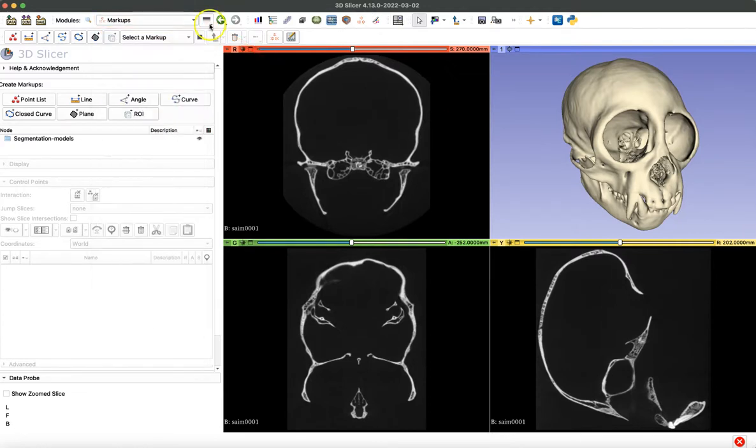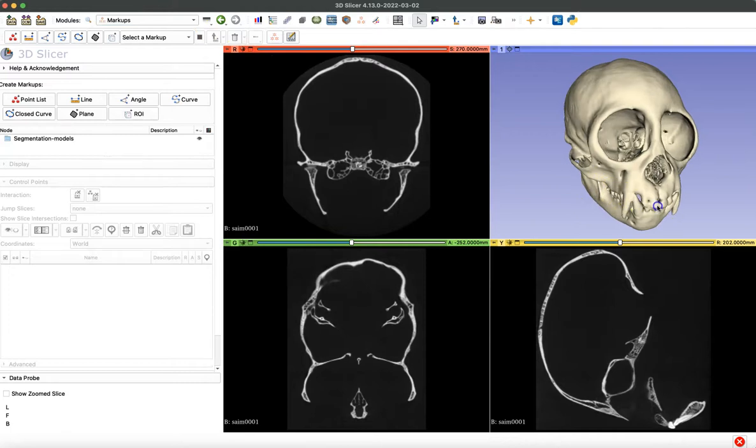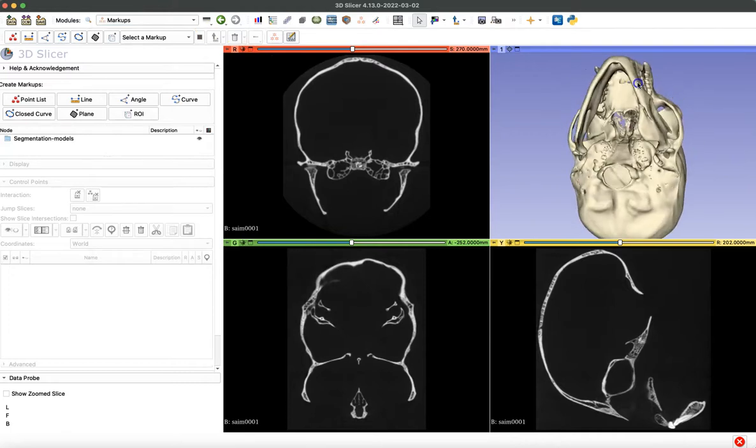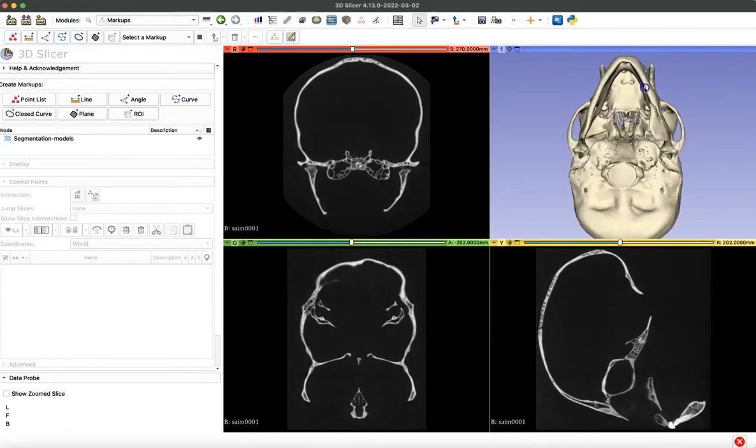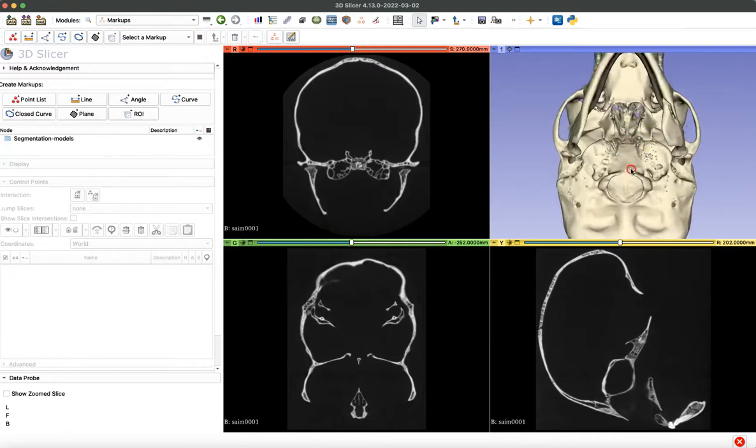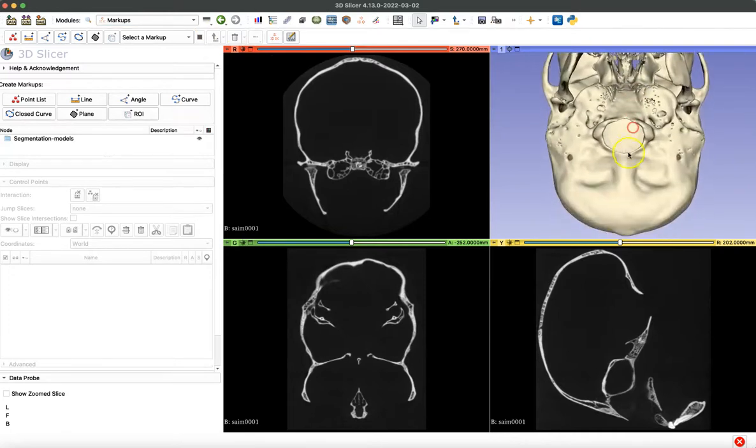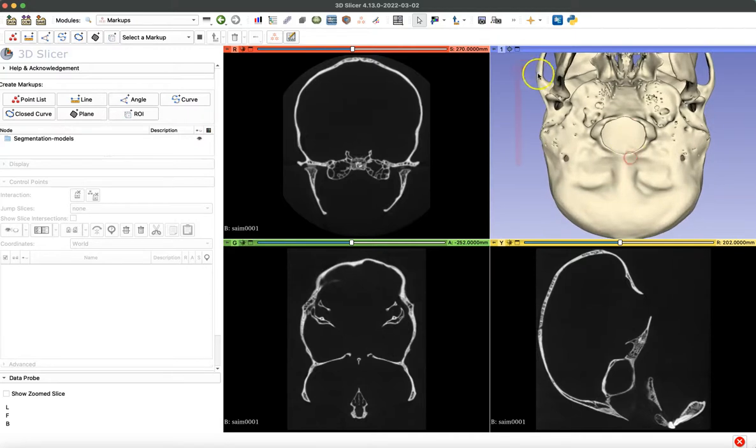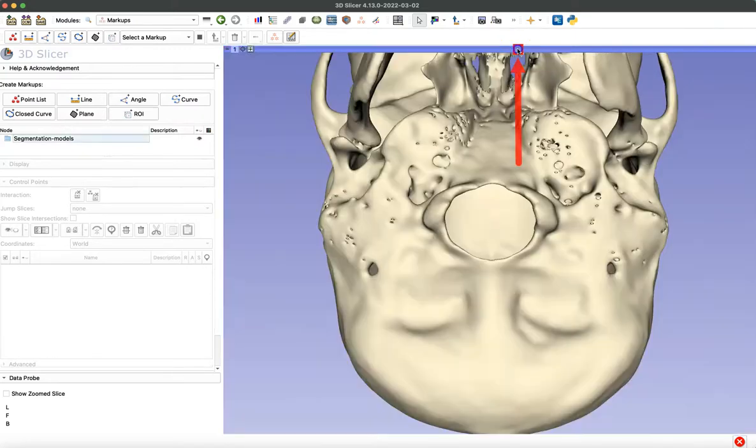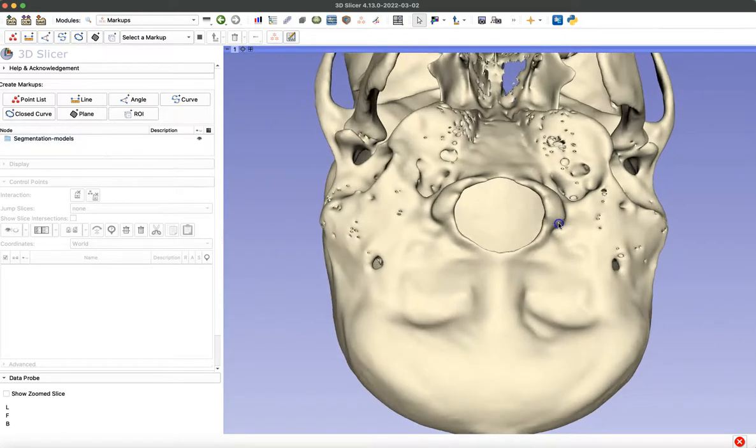Before you start, you want to orient your model into position so that you can clearly see the area where you want to take a length measurement. And then you can click on this icon to maximize that 3D viewer screen.